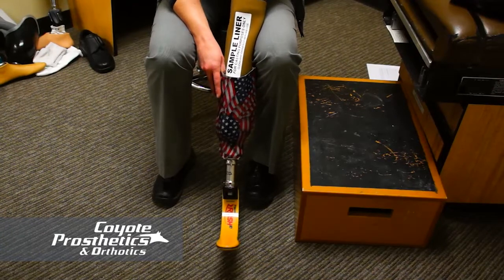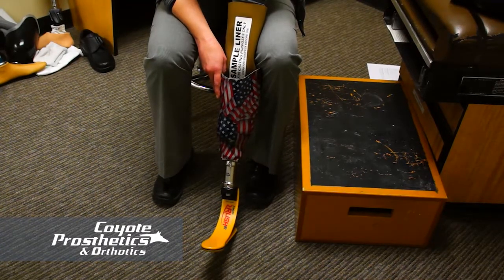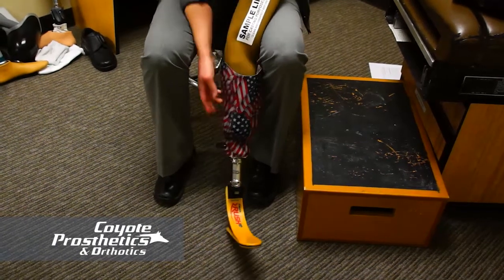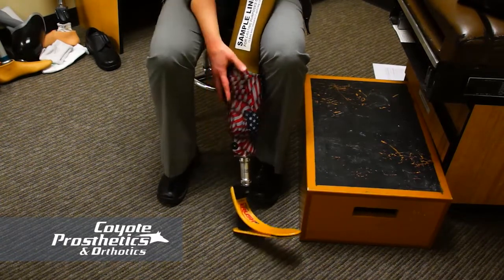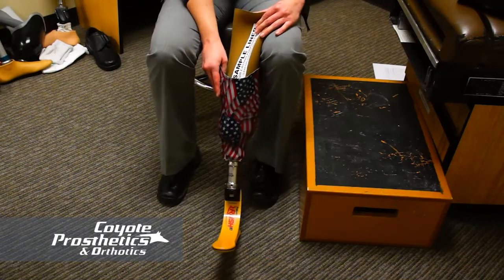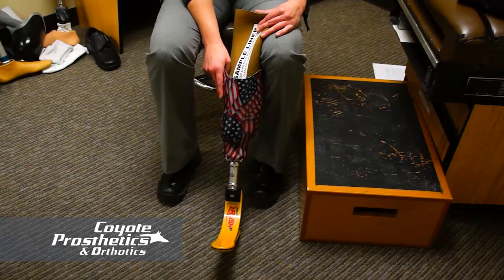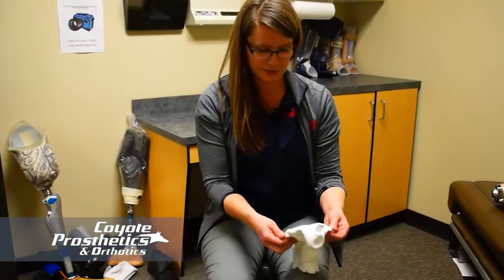As you walk around a little bit more, sometimes slowly you'll hear 1 click at a time. Take a couple more steps, and you can get another click. The reason that I am talking about this is because when you put your prosthetic on, if you hear this, and they all go in all at once, that's a sign that your prosthetic is too big at that time. How we resolve that is that you're going to add a prosthetic sock. So this is a prosthetic sock.